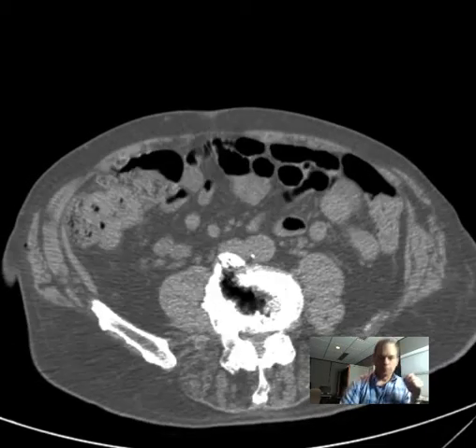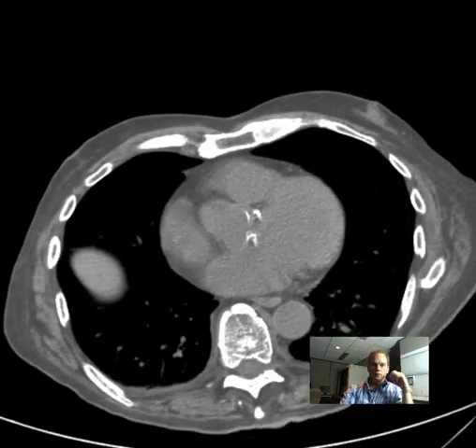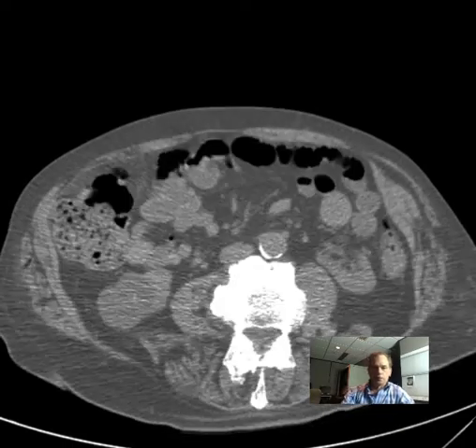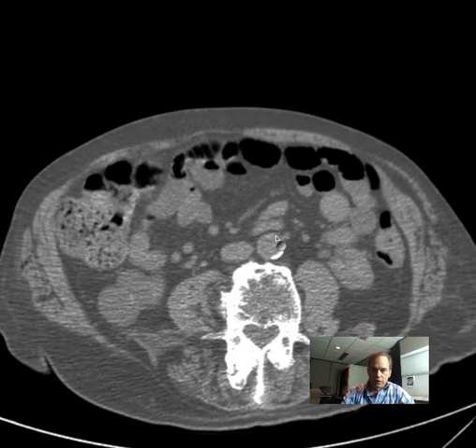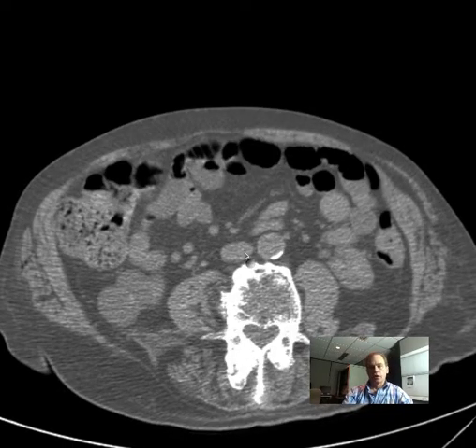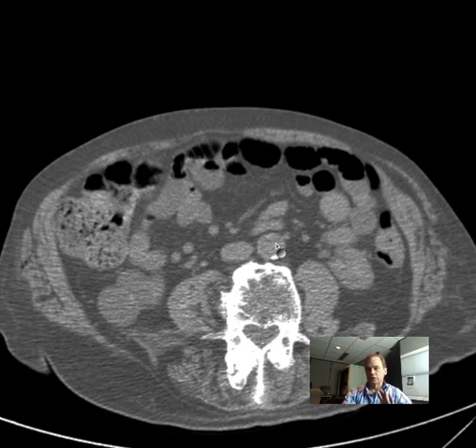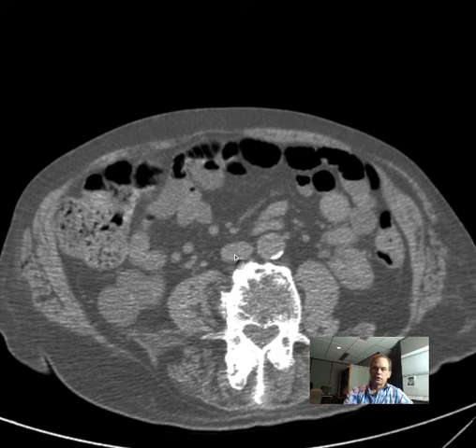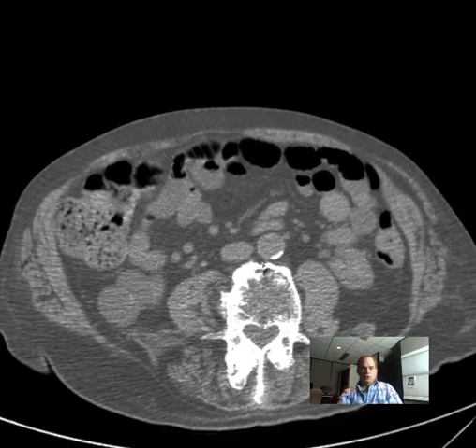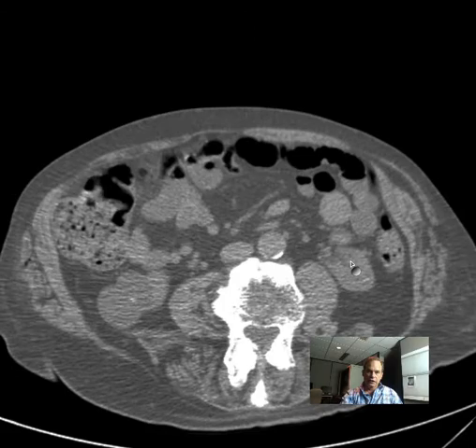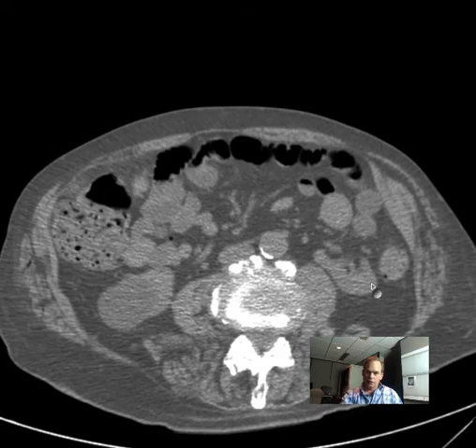What do we have here? The aorta and IVC. The aorta is basically always to the patient's left of midline, and the IVC is correspondingly on the right. These are retroperitoneal structures, so if you go to the left you'll see the kidney.